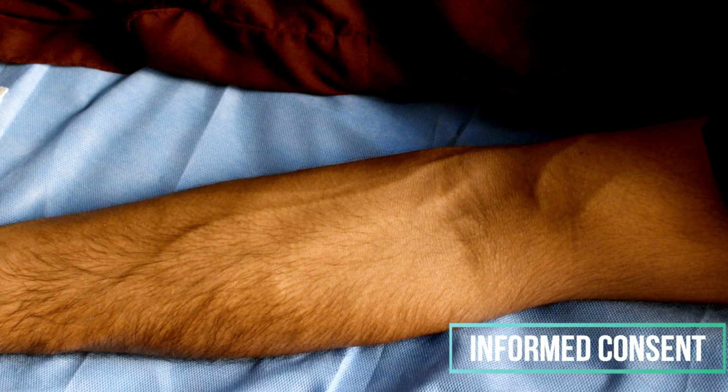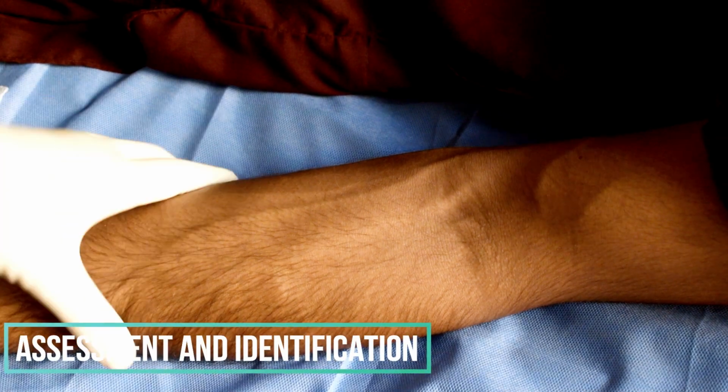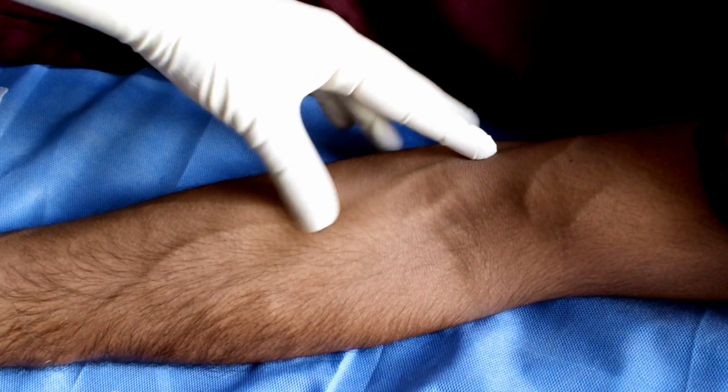The information regarding this procedure is given to the patient. The patient is also explained why this procedure is required, what the possible complications are, what the indication is, and what the precautions are, and then informed consent is taken. The hands are properly washed and the gloves are donned in a clean or sterile technique. An assessment of the site of the cannulation is done and the vessels are identified.